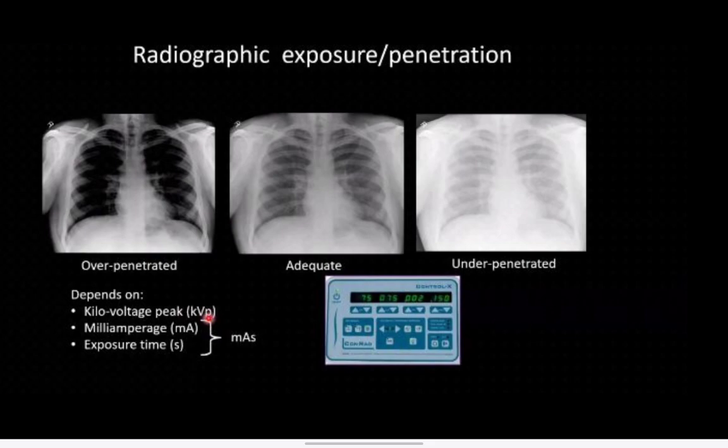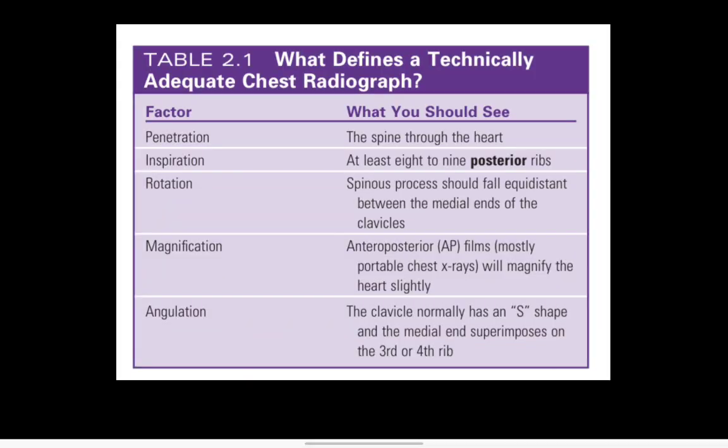Moving to adequacy of quality in chest radiograph. When to say the image is good quality or poor quality chest radiograph. We have components to specify the main quality of the chest X-ray. The first is the penetration, inspiration, and rotation. Added to it, magnification and angulation.